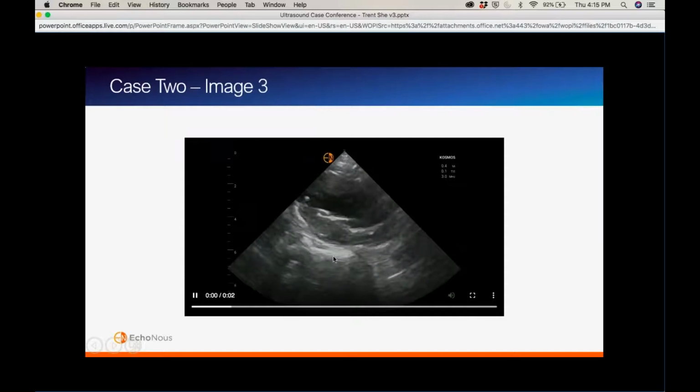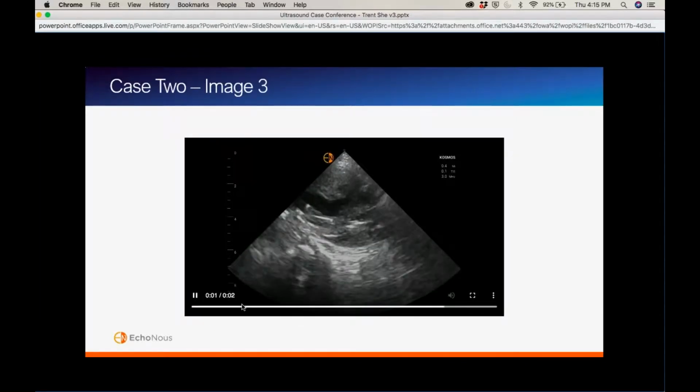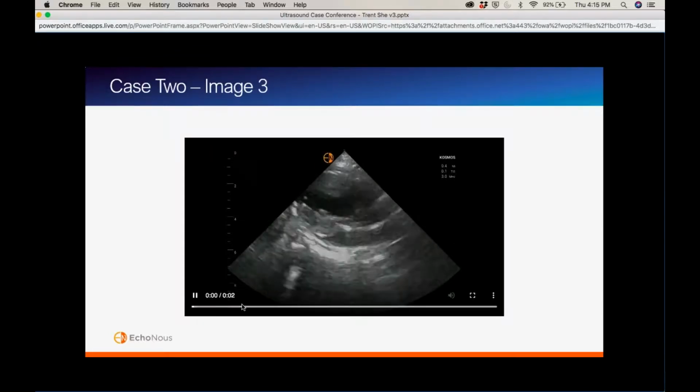I mean, this kind of goes back to your point earlier. This is a 2-second clip. You can always lengthen the clip length just a bit so that you can really take your time going through these images. We like to see the clip not on the screen, and then as you fan, it appears. You fan all the way through it, and then it disappears. This way we get a great understanding of what it is you're looking at.